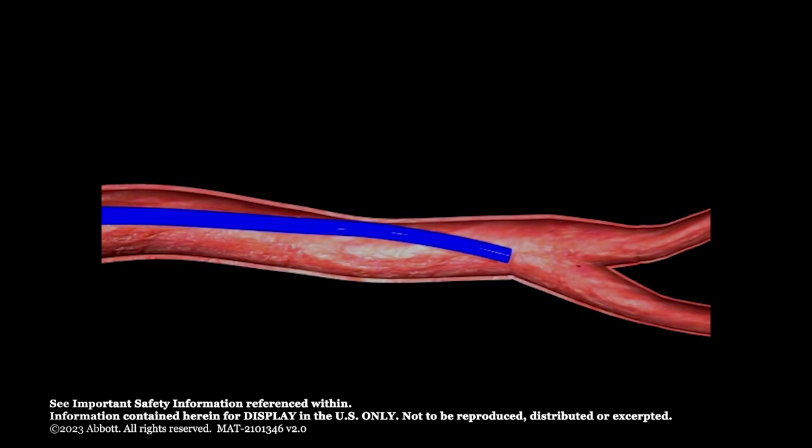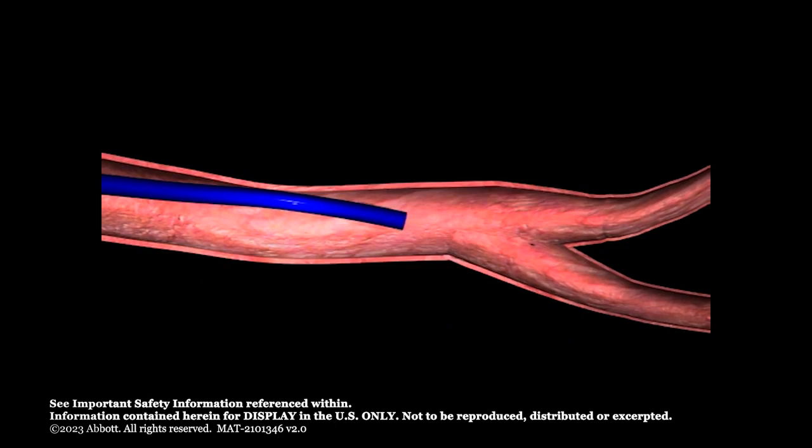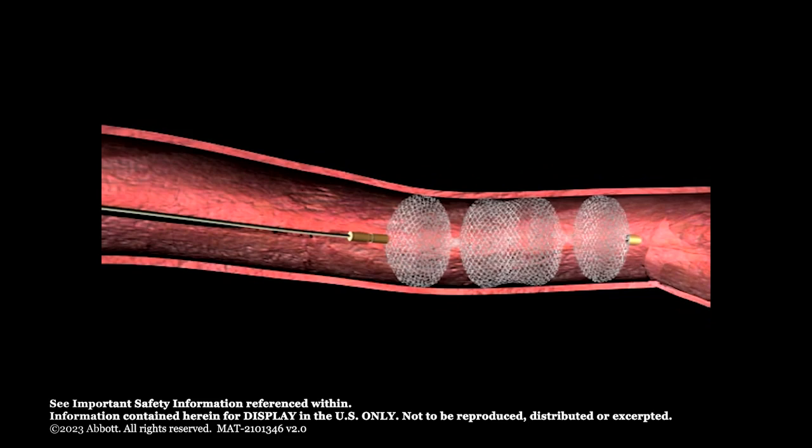Advance the Amplatzer Vascular Plug 2 up to the delivery system distal tip with the delivery wire. Do not twist or rotate the delivery wire during advancement. Adjust the sheath or catheter position if required to ensure the distal end of the plug will deploy at the distal edge of the occlusion site. Stabilize the delivery wire and gently pull the sheath or guide catheter back to deploy the plug in the vessel. The plug should expand to completely oppose the vessel wall and should create three zones of apposition within the vessel.